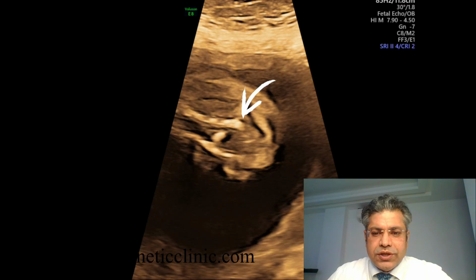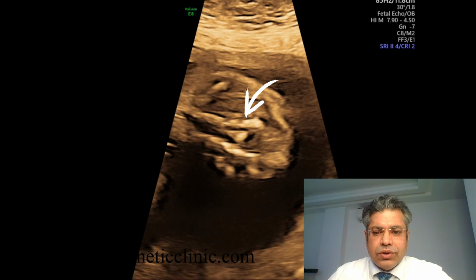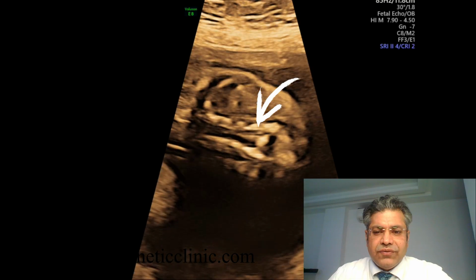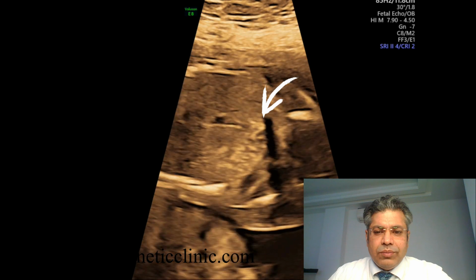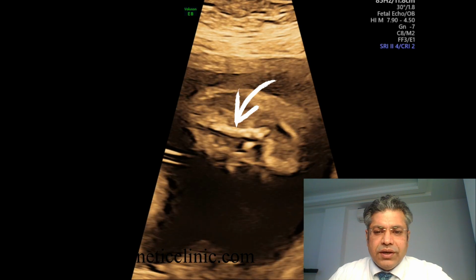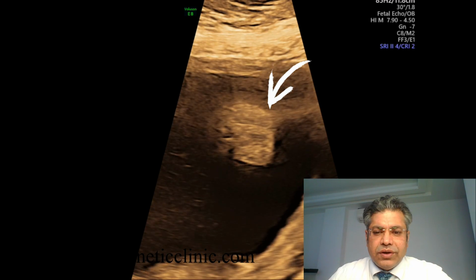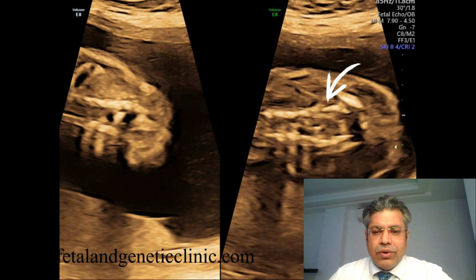So here are two bony spurs and diastematomyelia, and we just saw the split. This is the split cord, and then we can delineate the syrinx going on and below, and a variable amount of caudal regression, and segmentation defects in the lower spinal cord.